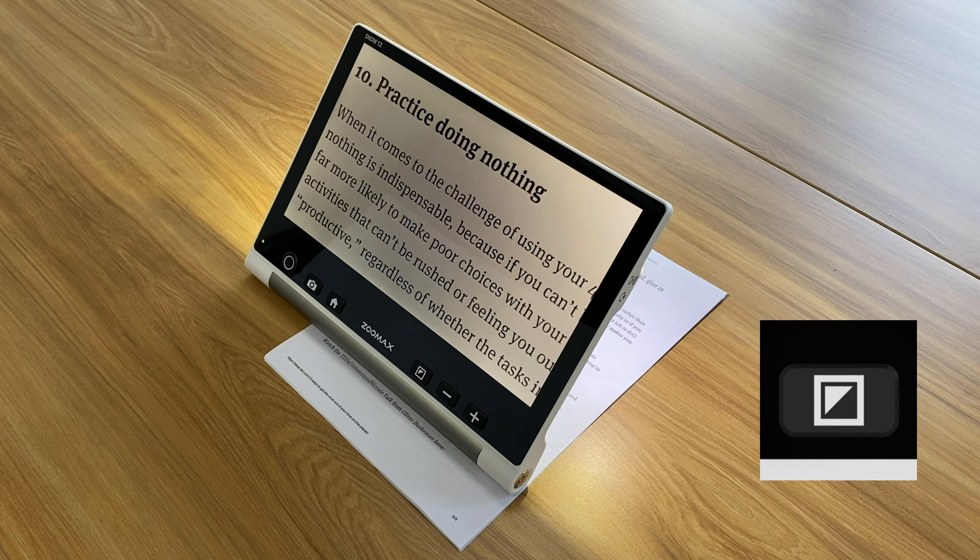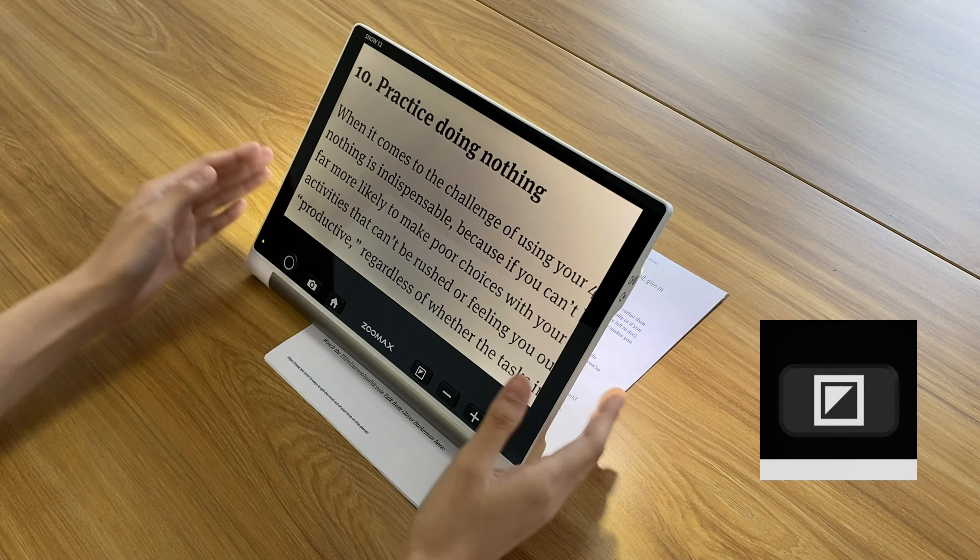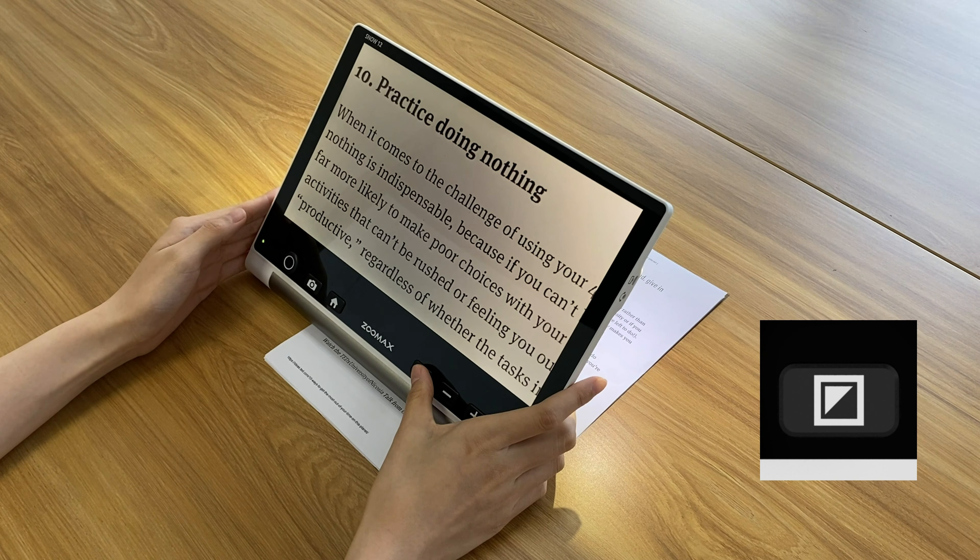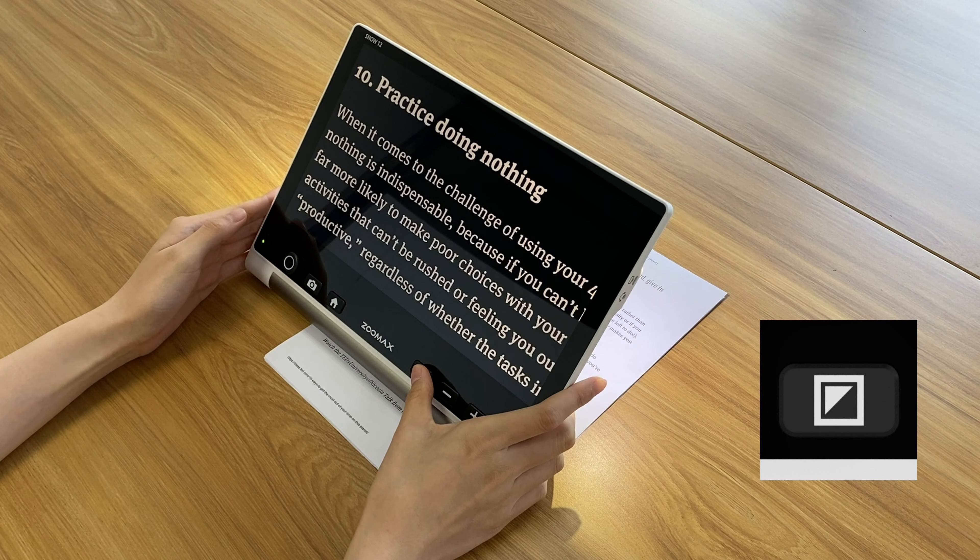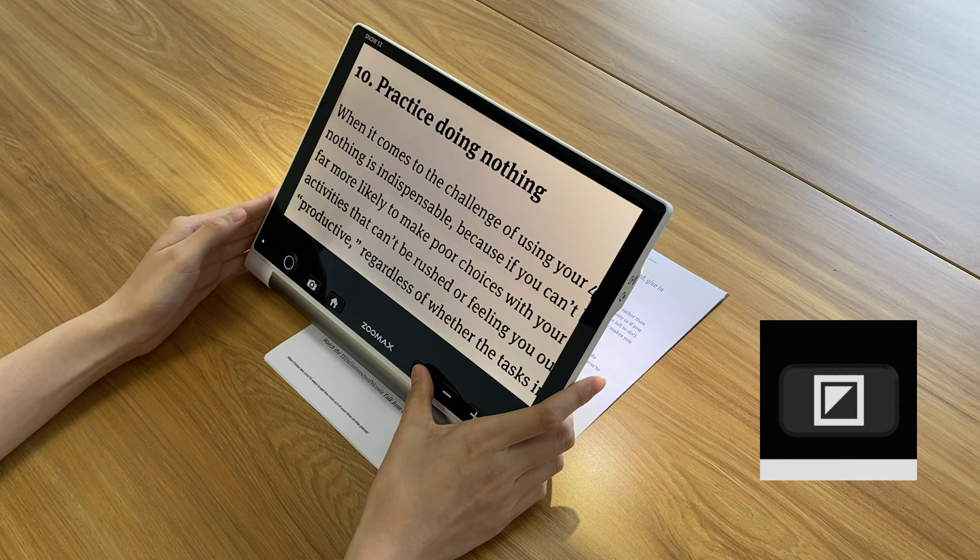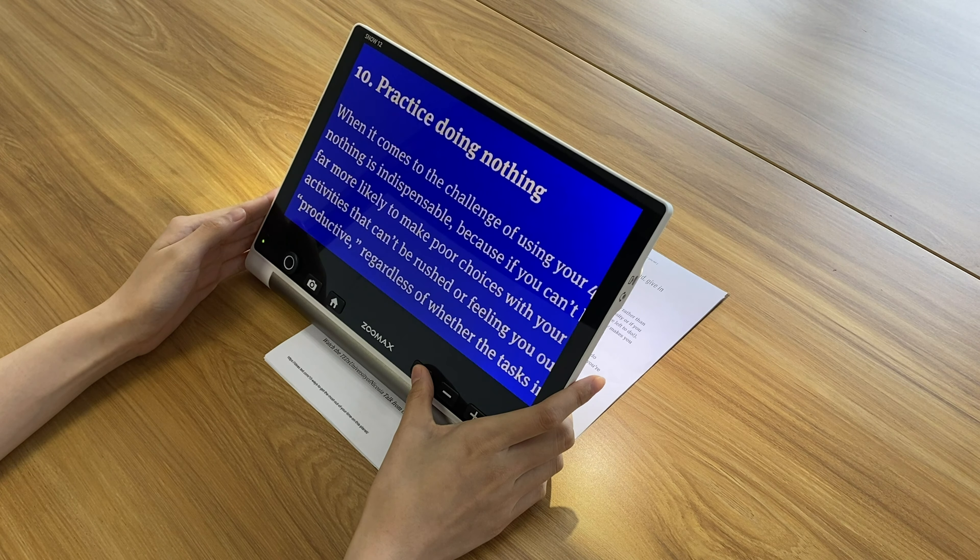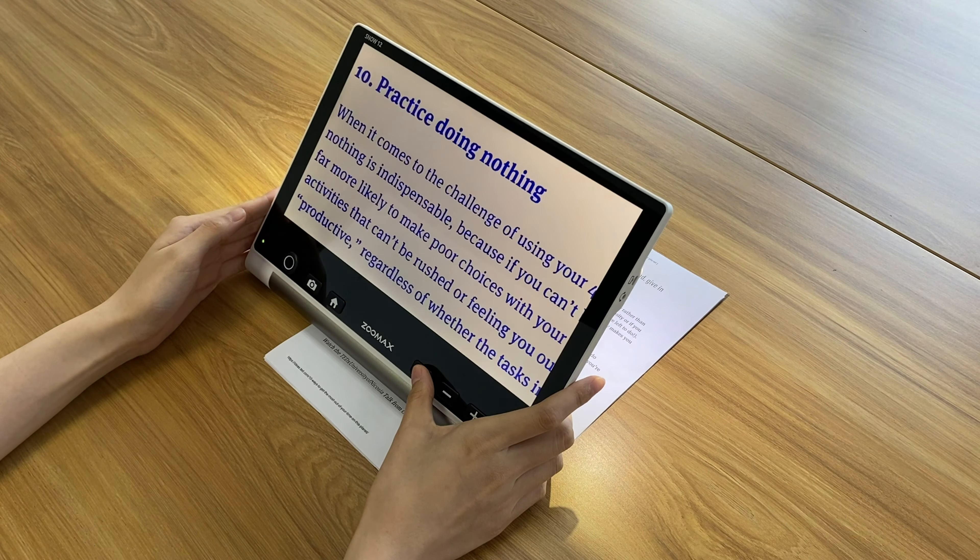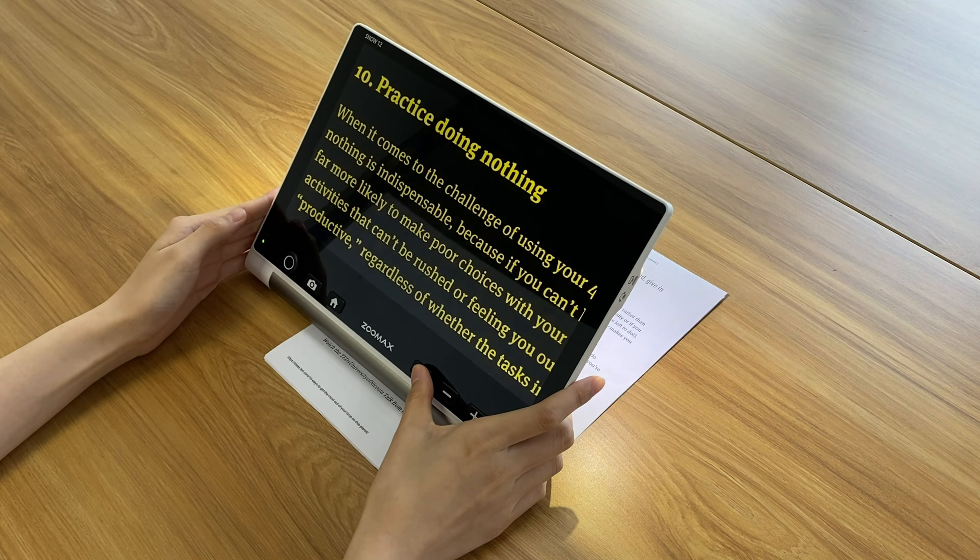To read with high contrast color, press the mode button to choose one color you need. Up to 10 high contrast colors are available.